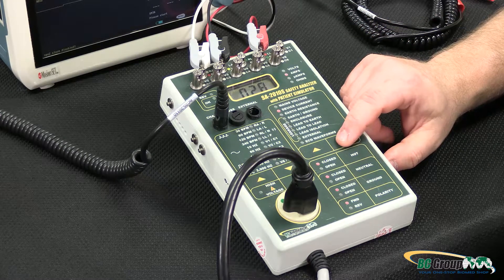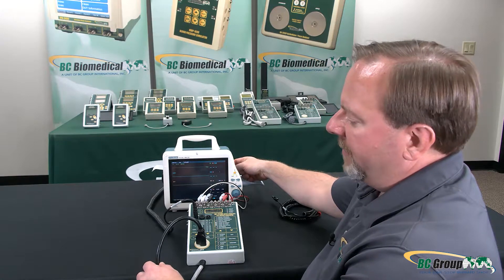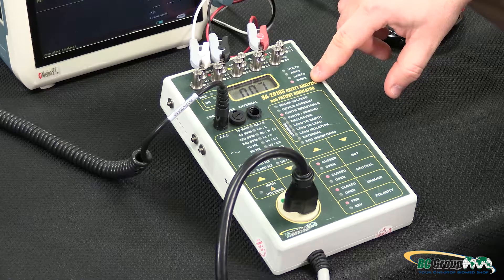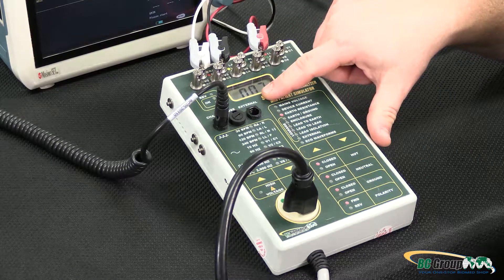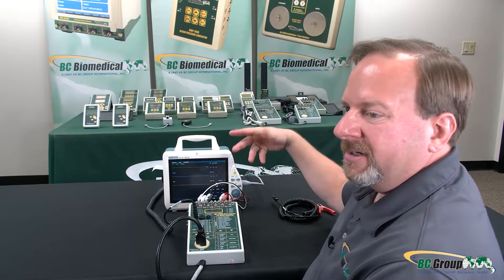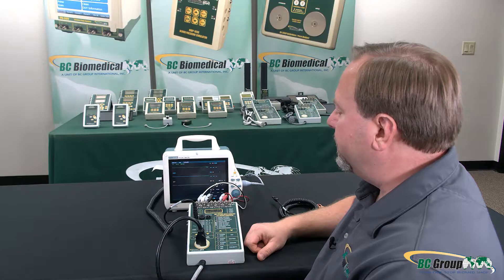Then we can advance to earth resistance. This is measuring the resistance from the ground terminal on the back of the DUT through the power cord to its earth ground. In this case we can see we have 0.07 ohms resistance. If we have a high reading here, we may want to make sure we get a good connection on the back of the device under test — there may be some corrosion or buildup on that terminal, so you may need to scrape it. In this case 0.07, 0.06 ohms — that's a good reading.